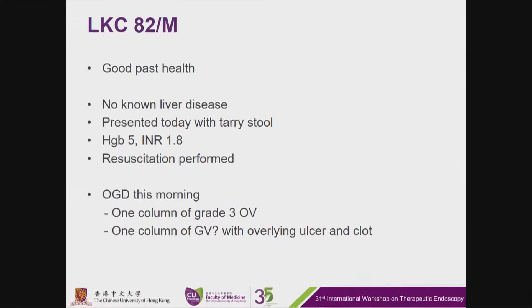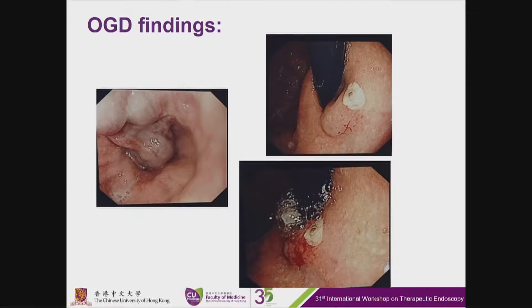OGD this morning found one column of grade 3 esophageal varices, and also one column of query gastric varices with overlying ulcer and clot. This is the OGD finding with clinical photos showing the esophageal varices and the query gastric varices with ulcer and clot.